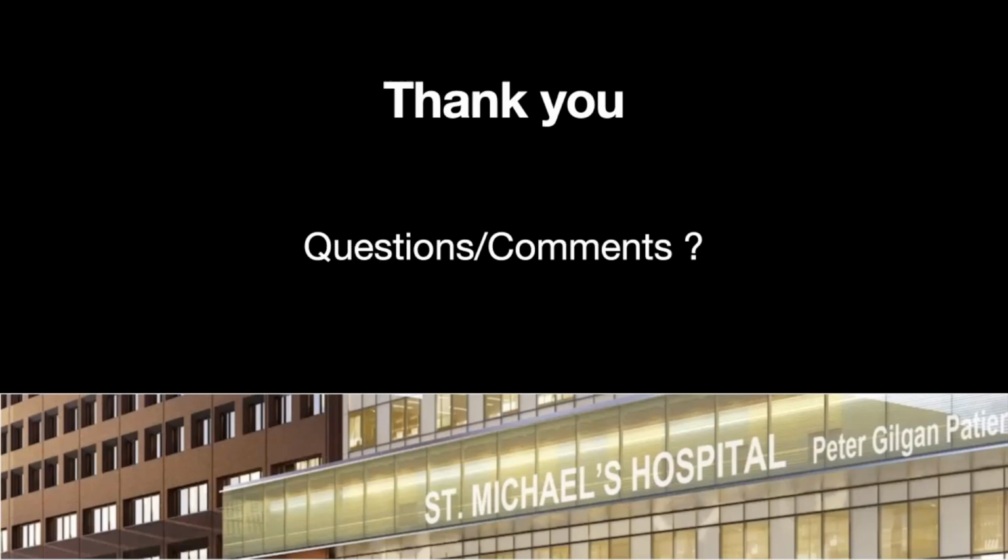It's not easy to do, and I think maybe less useful than some people like to think it is. Obviously you're making multiple measurements again, V1, V2 every time, and they all need to be perfect. So just to say that we talk about dobutamine being a nice solution for low flow, low gradient, challenging, I would suggest.